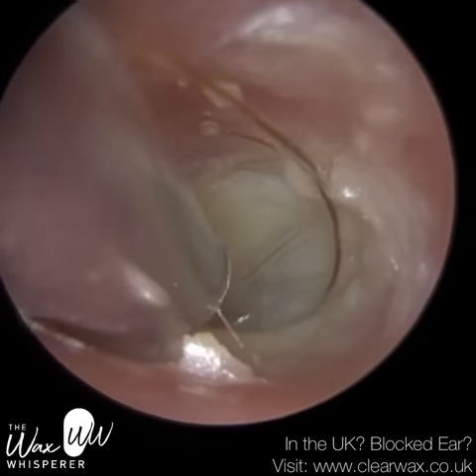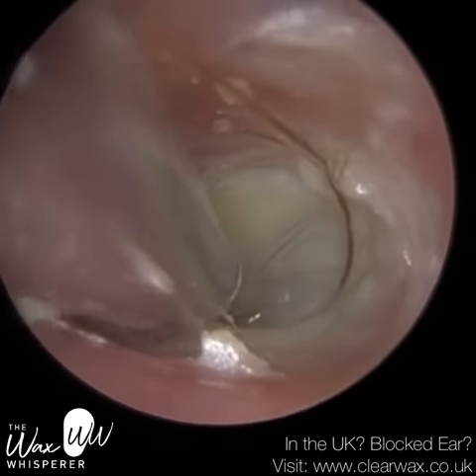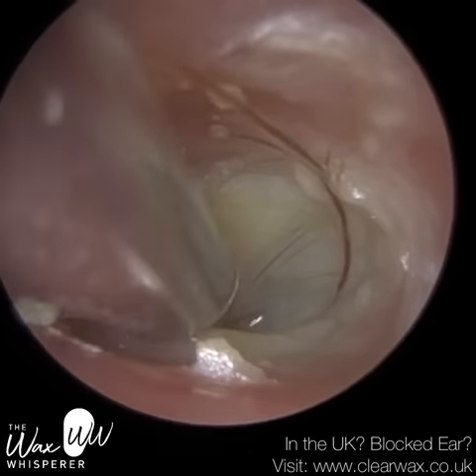So as you can see, I'm just performing microsuction to remove all this very thick, creamy, purulent discharge.